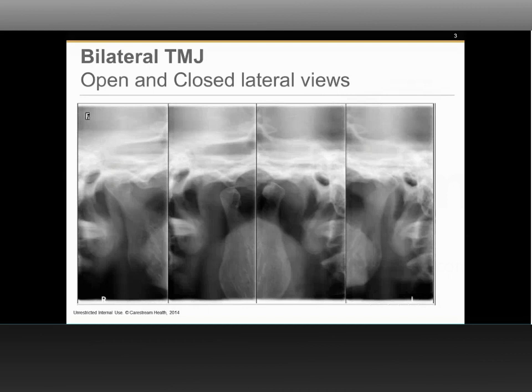So you're emphasizing that it's the third dimension that's critical, and that's what's missing from the 2D radiographs. I think you have nailed the point. That is exactly what it is. It is the third dimension, as I've mentioned earlier in our previous discussions. A 2D image is nothing but a two-dimensional representation of a three-dimensional structure. So one of the things that we lose is the third dimension, which is nothing but the depth. You can analyze the breadth, the width or the height, but you're not able to assess the depth, which is the third dimension. And by moving towards CBCT imaging or any form of third-dimensional imaging, that is one of the biggest advantages. You are able to now see that dimension which could not have been visualized on a static radiograph.